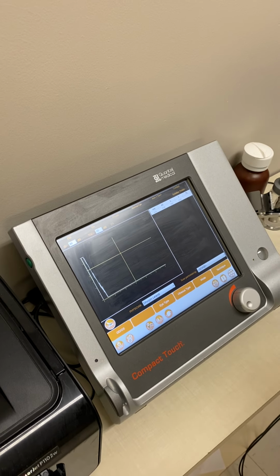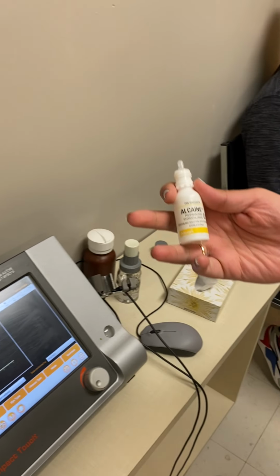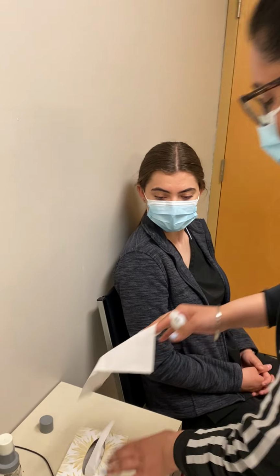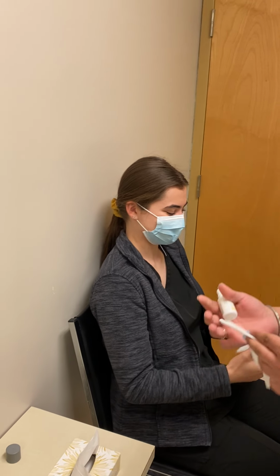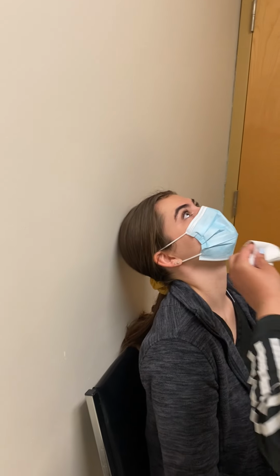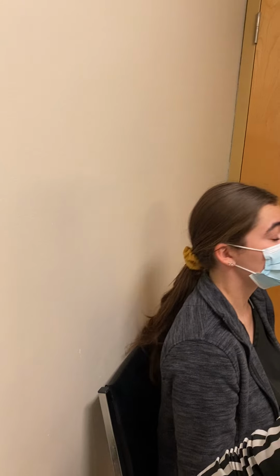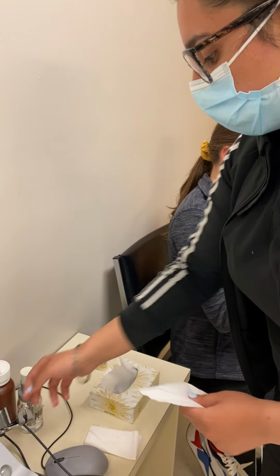So after her information's in, I'm going to put the freezing drops, which is the Alcaine. It works instantly, so I'm going to put a couple of drops in Robin's eye. Thank you. You always want to give them some tissues. Robin, I'll get you to look up. You did good, Robin.